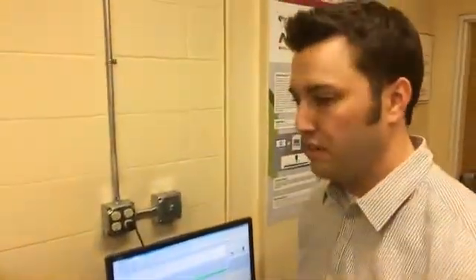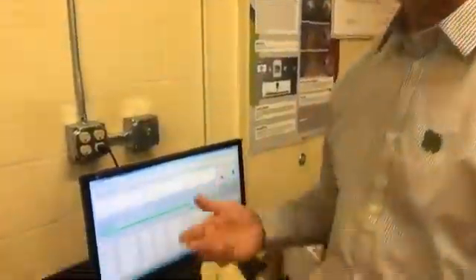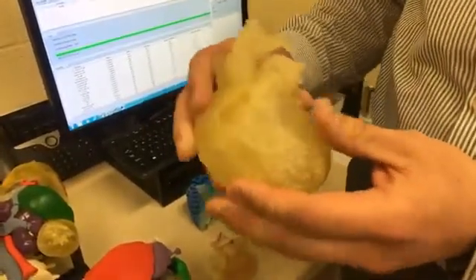Absolutely. Well, let's get to the models. Where did we start? So we started in cardiothoracic surgery, so that's where my background is in imaging. They brought me in to help oversee some of those things. So we started with making replicas of hearts that basically were going to need heart surgeries. This is similar to the first models that we make. It's out of a rubber material that simulates the tissue of a heart.